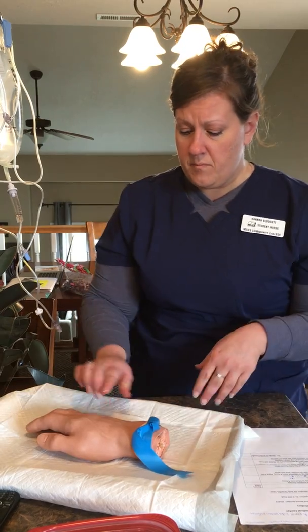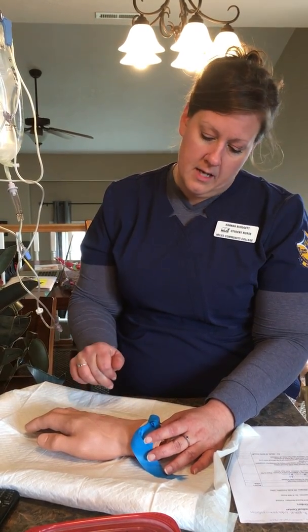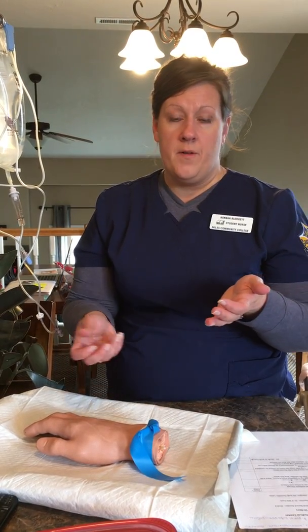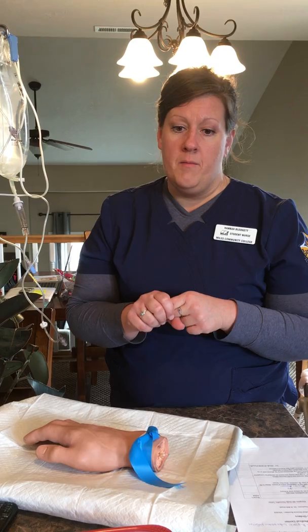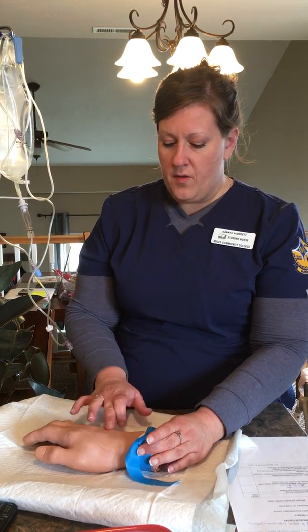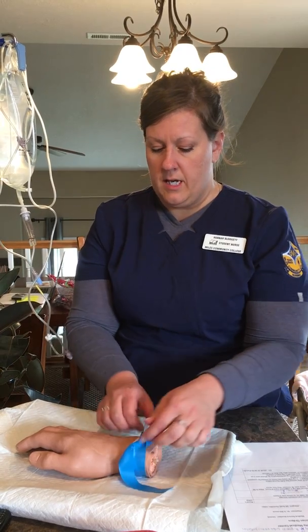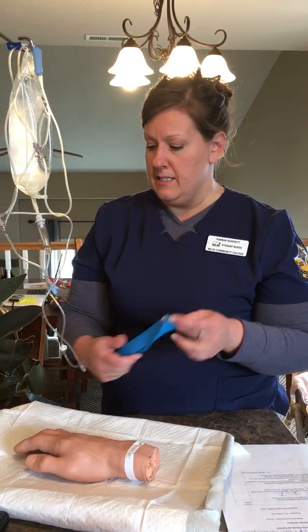Then I'm going to palpate, looking for a good vein that is going to be able to withstand the needle. For this patient, you would want to verify the needle size depending on the age and what you're infusing, making sure that it is an appropriate needle. Today we're going to use a 20 gauge on this patient. Once I've located it and made sure that it is going to work for our needs, I would remove the tourniquet and go get my supplies.